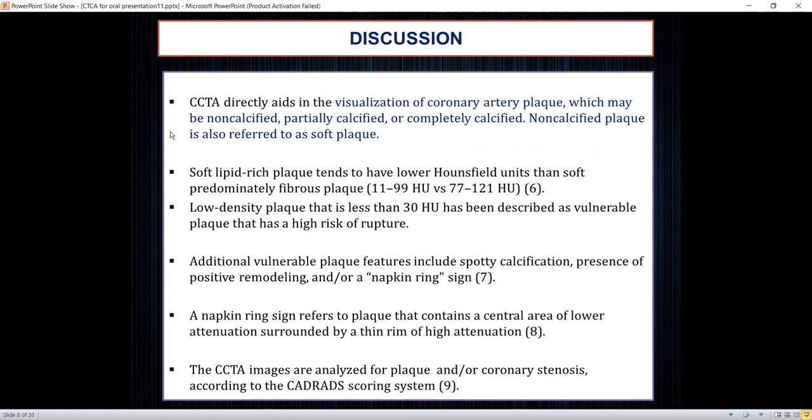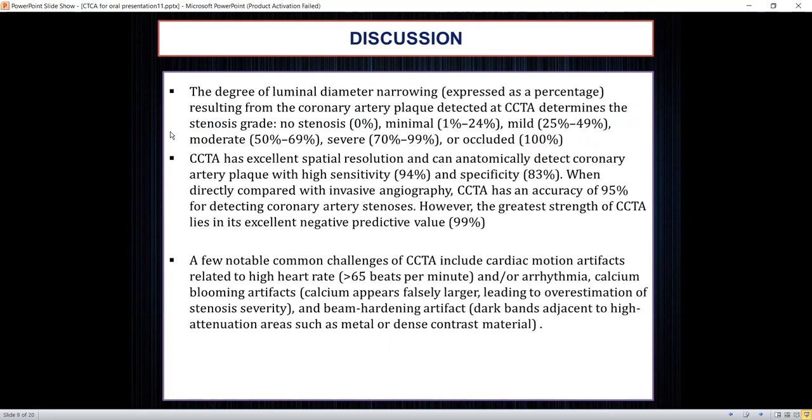The napkin ring sign refers to a plaque with a central hypo-attenuation area surrounded by a high-attenuation rim. CT angiography images were analyzed for plaque and coronary stenosis according to a grading system, graded accordingly from non-calcified to completely occluded arteries.